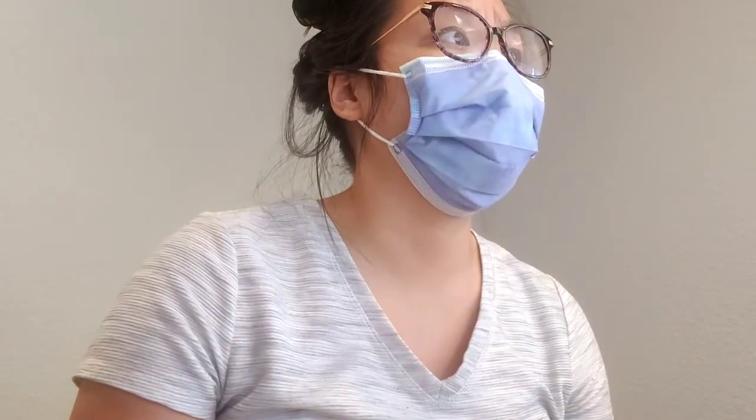Next question. To assure quality image of post-processing reformats of the ankle joint, a blank millimeter scan thickness and a blank millimeter scan interval is appropriate. So I went with the smallest one. No, the second smallest ones. It's 0.75 to 0.4. Got that right. And they try to trick me with 0.75 and 0.04, but that's too small. That's like a volume scan, really small volume scan, because you really want to see the ankle joint. You want it small to see if any fractures there.